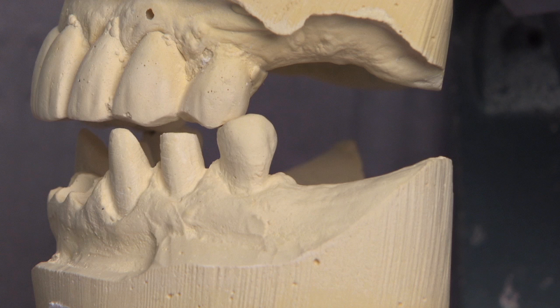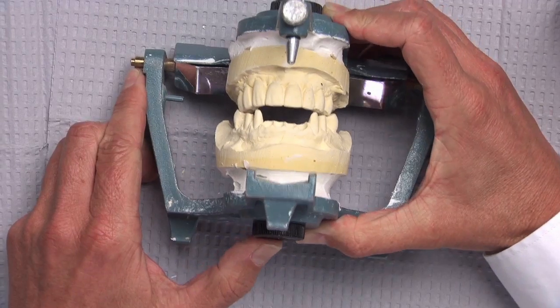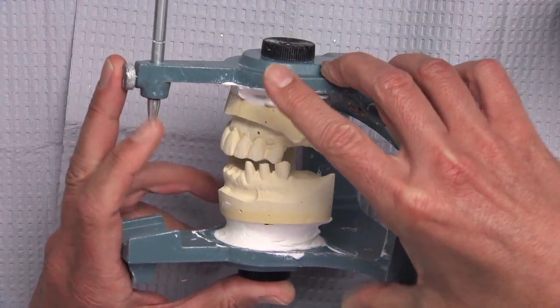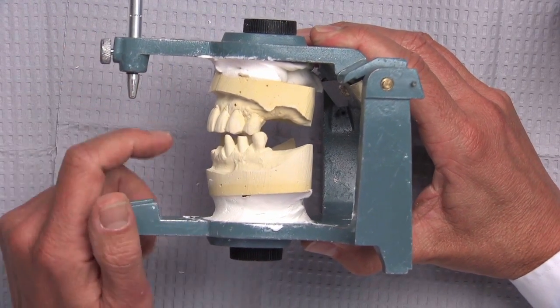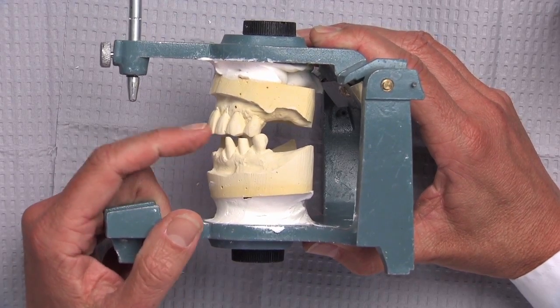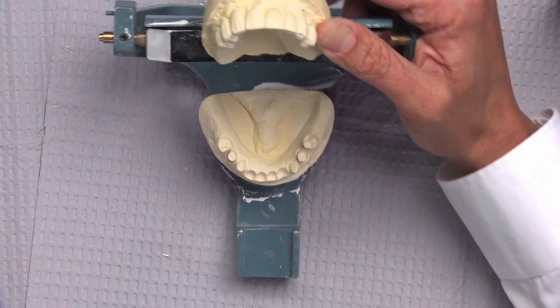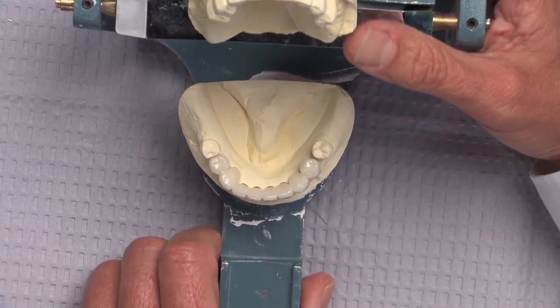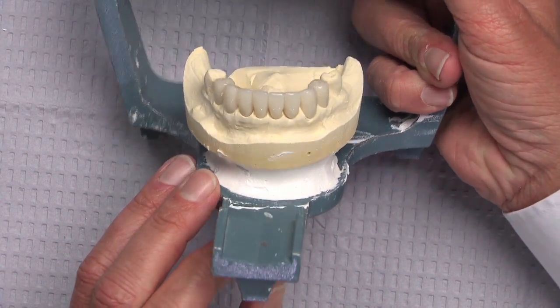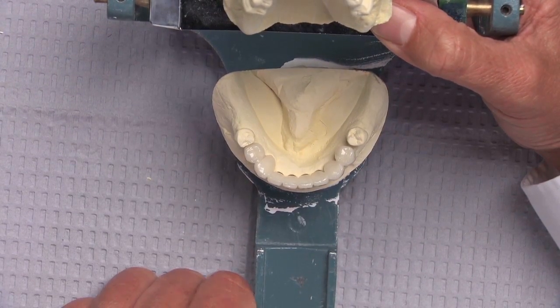During this entire procedure — during provisionalization, when he reelines the bio temp, when he takes final impressions and final bite registration — because he has kept these teeth in contact, he's maintained his vertical stop. Losing vertical and the patient not being able to get back to their bite is a troublesome thing, and it definitely happens in full arch or full mouth cases. By leaving these most distal two teeth unprepared, he's making sure he's always got his vertical, so when he puts the final restoration into place he knows the patient is biting in the same place they were before. It'll be up to the dentist whether or not these two teeth need to be crowned at a later date, but keeping those stops is a great way to do it.